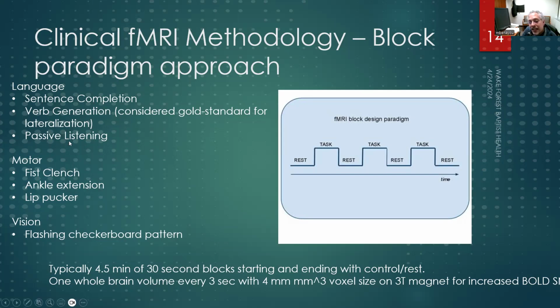So I've had patients we've done fMRIs on who were sedated and intubated on anesthesia. And if you lighten the anesthesia just to the point that they're going to take out the endotracheal tube and extubate themselves, if you get just up to that edge but don't cross it, and just play passive listening, like a story being read in their native language, you can activate their language areas enough to often get a good indication of where their specific language areas are.